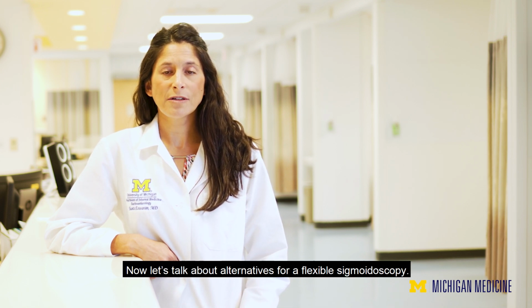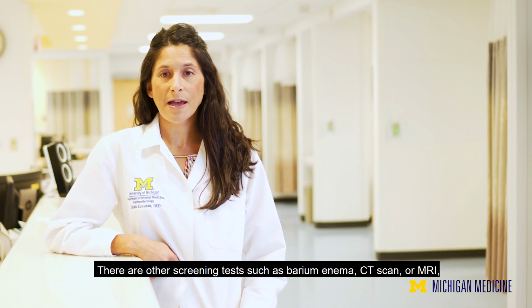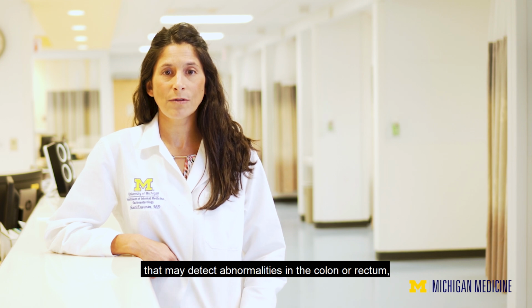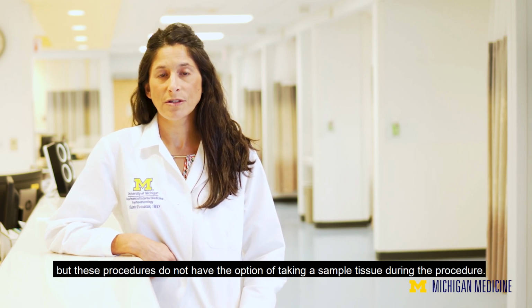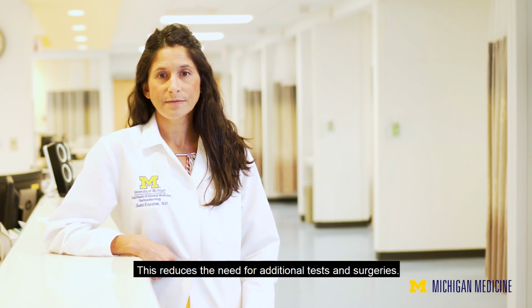Now let's talk about alternatives for a flexible sigmoidoscopy. There are other screening tests such as barium enema, CT scan, or MRI that may detect abnormalities in the colon or rectum, but these procedures do not have the option of taking a tissue sample during the procedure. This reduces the need for additional tests and surgeries.